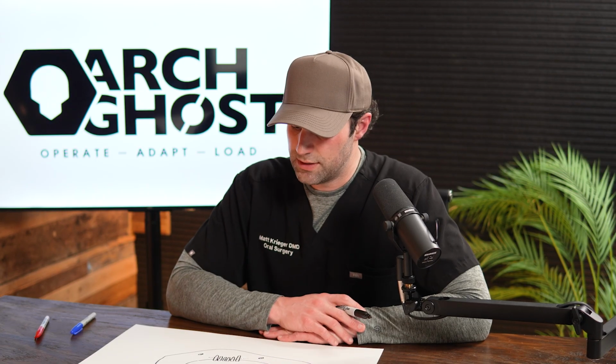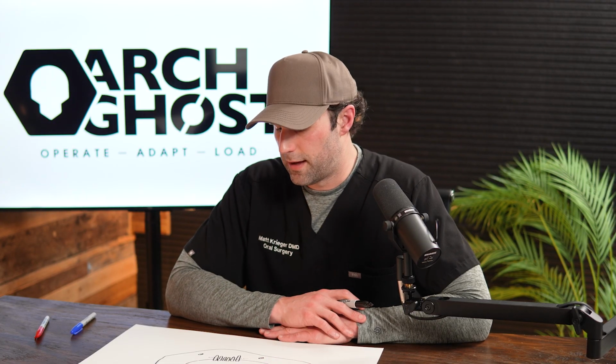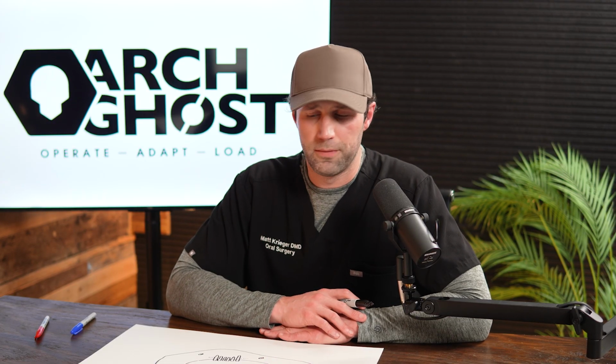I do have an article on the website that teaches you how you should be checking your reduction intraoperatively, but this is just an ID point so that you can tell, even if you took a measurement, if you have a significant amount of that socket left, you might say, you know what, I need to double check that, because usually that's not the case. So that's the real key there.